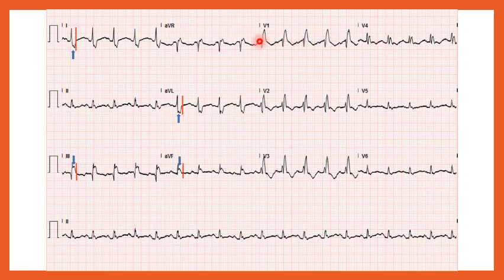And so we look at the configuration of the QRS complex in V1, and we see that this patient has RSR prime configuration in V1. Widened QRS got us started. Then we went to RSR prime configuration in V1, and then V6. Okay, we see R, I don't know, is that a slurred S? If you have any questions, head over to V6's partner over here, and that's lead 1. And so in lead 1, you can certainly see the tall R, the slurred sloppy S at the end, and yes, indeed, you have a right bundle branch block here.